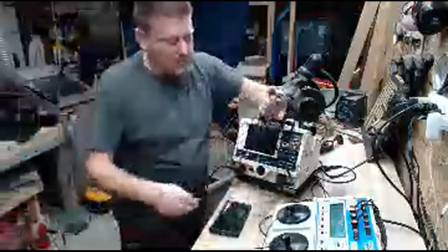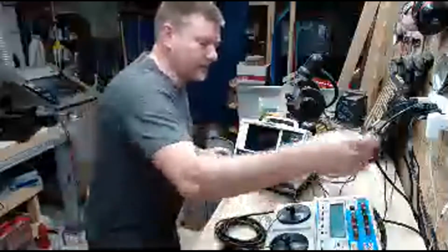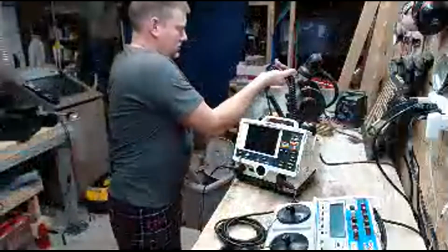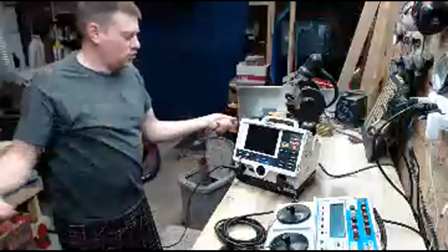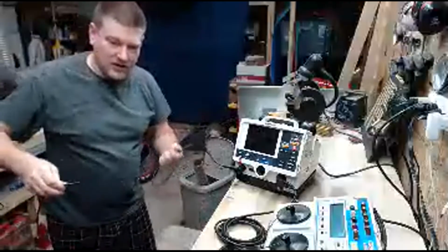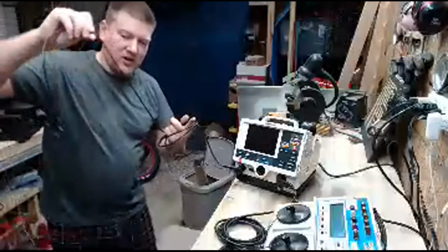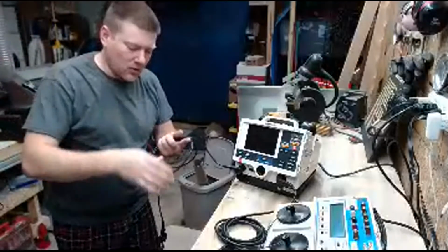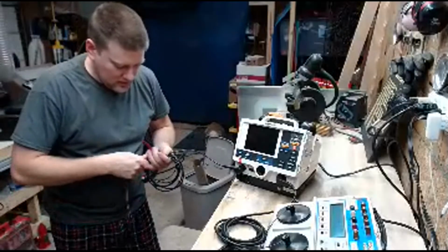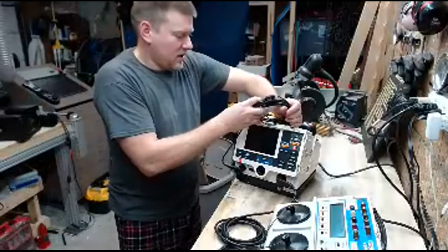So when I set these things up, I will coil up the main cord in front, and I take the ECG cord. I start here near the defib, go about a half a foot to a foot out, and just start coiling. And I'll rotate the cord, and it falls naturally into a coil pattern like this, just to make sure none of it tangles up.